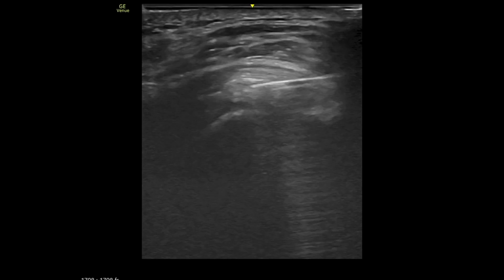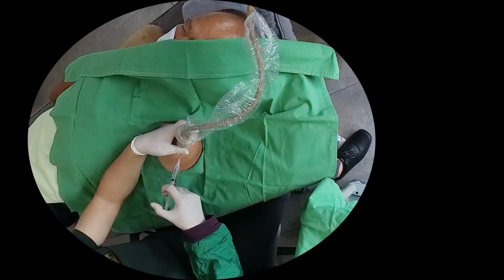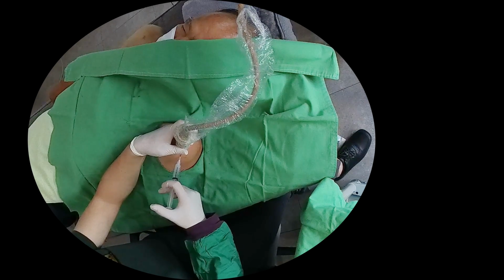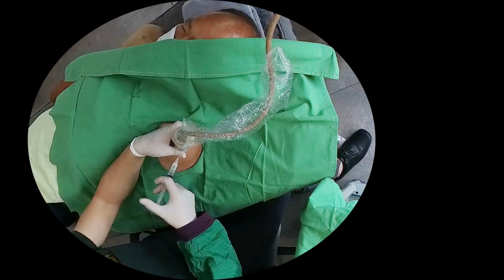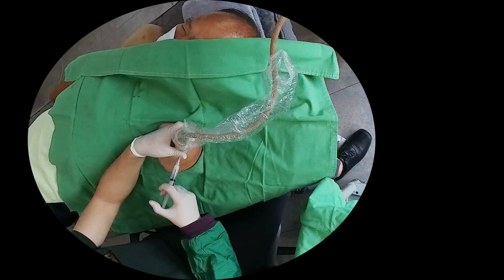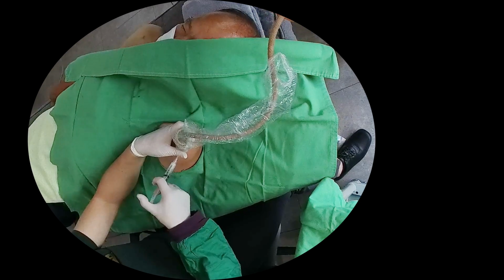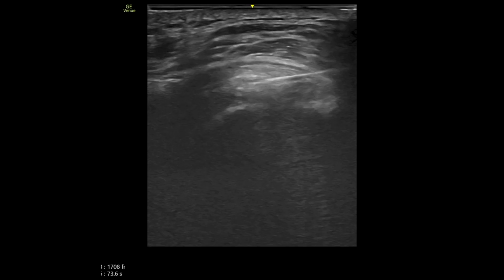Barbotage. Attach a 5 ml syringe filled with 3-4 ml of 1% lidocaine to the 18-gauge needle. Inject the lidocaine gently and slowly to mix with the calcium particles. Once mixed, the solution can be easily aspirated. Caution: the initial step of the barbotage is critical. Too much force can rupture the calcium capsule, resulting in a failed procedure. Gentle, consistent pressure ensures effective mixing and aspiration of the calcium.